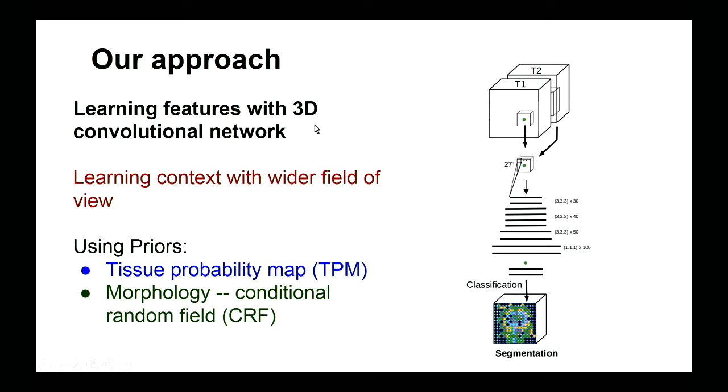As Michael Rosen showed before, these are tools for image recognition. These are deep learning models. So this is the backbone of the model that we're using. This is a 3D convolutional network, trained on recognizing 3D images and segmenting them, which is assigning one label to each pixel in the image. We call this model the vanilla model, because it doesn't have any awareness of space, location, or morphology. This is just a neural network that is trained on taking small volumetric patches from a 3D MRI and predicting the label of the center voxel. So this is all working on volumetric features.